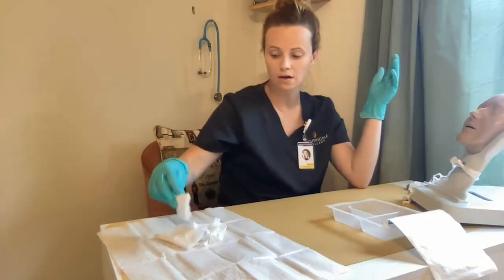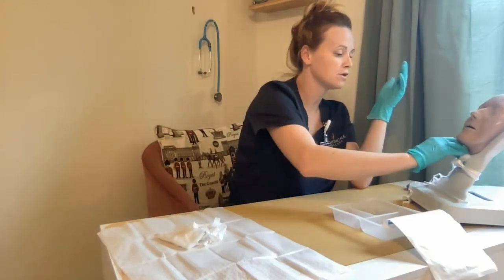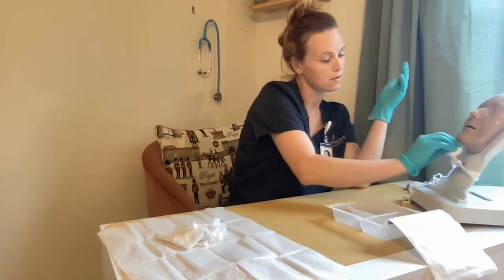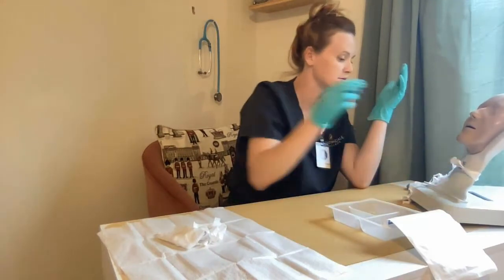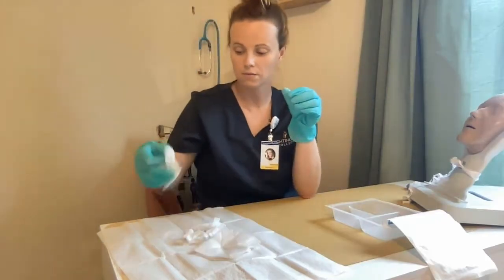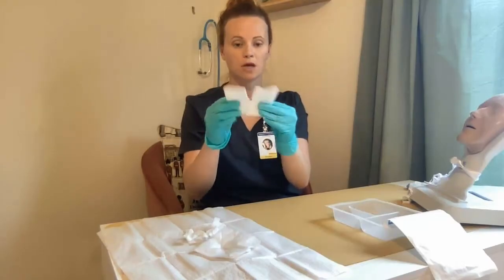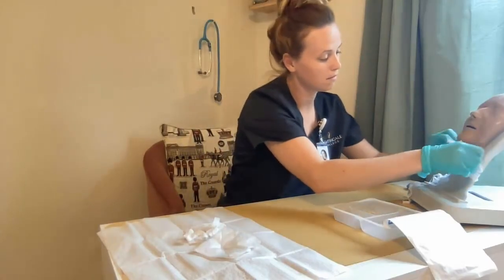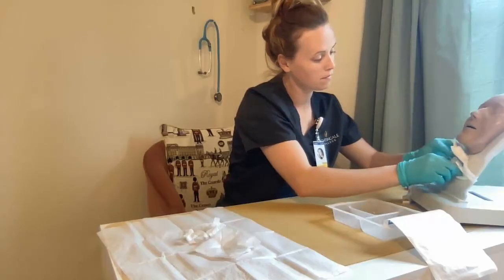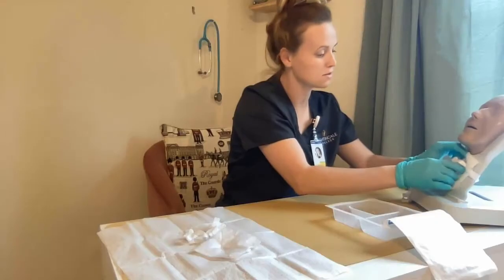I'm going to get the gauze here — excuse me, gauze — and dry my patient. After I ensure it's dry, I'm going to dispose of that. I then want to get the split gauze that goes around the tracheostomy and apply that, making sure that it is secured properly.